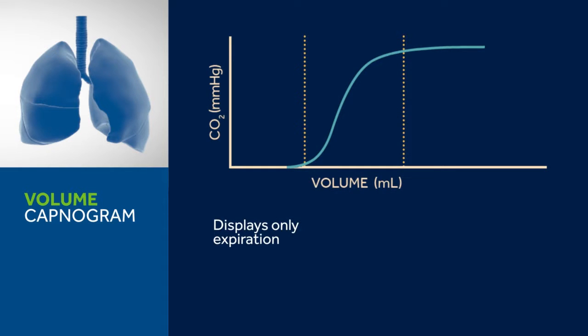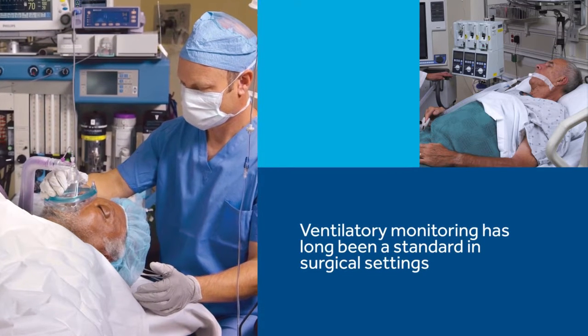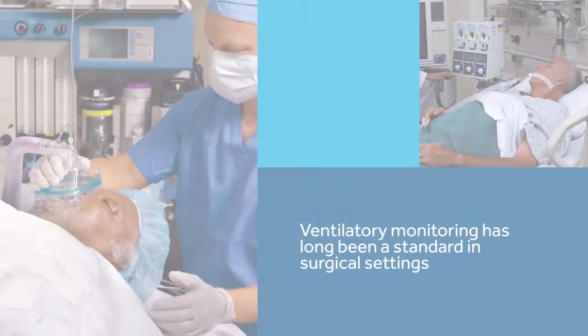Volumetric capnography is used to evaluate the efficiency of lung ventilation by calculating dead space. This is typically used on patients receiving mechanical ventilation. Historically, capnography has been used primarily by anesthesiologists to identify ventilation situations that could lead to hypoxia if uncorrected.